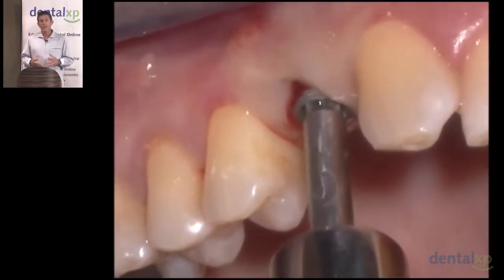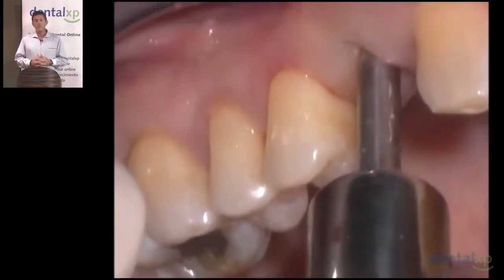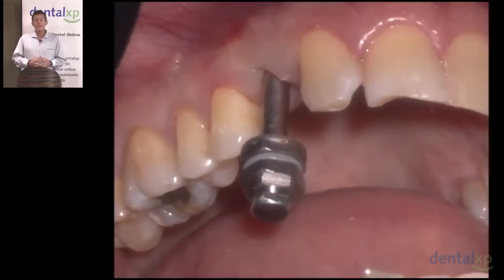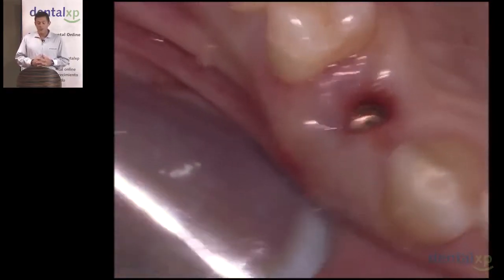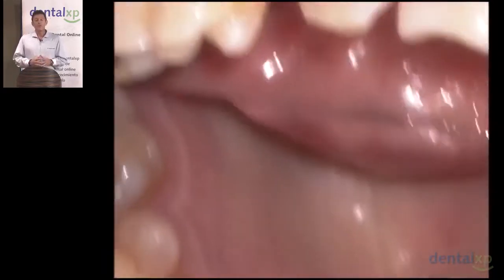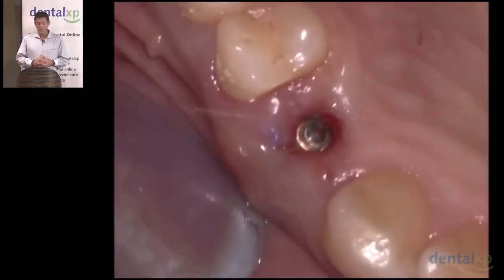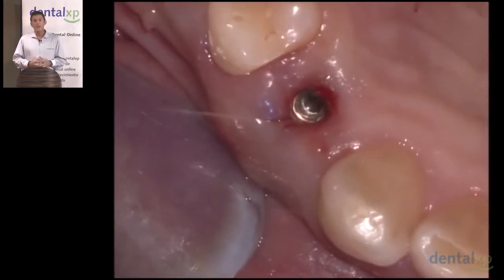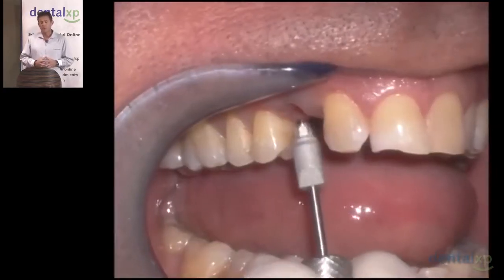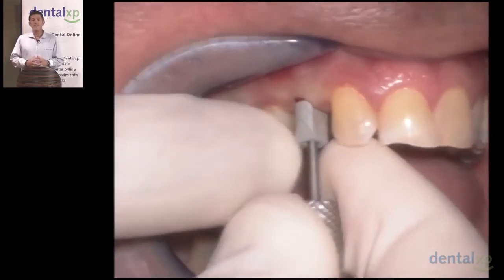This implant has a spherical design, tapered thread with micro grooves, and now we're going to hand ratchet and tighten the implant down to its final placement, approximately 3 millimeters below the future margin of the restoration or the height of the gingiva. We're now making sure that the implant is placed at the appropriate depth for future restoration. And immediately we are going to place a scan body.